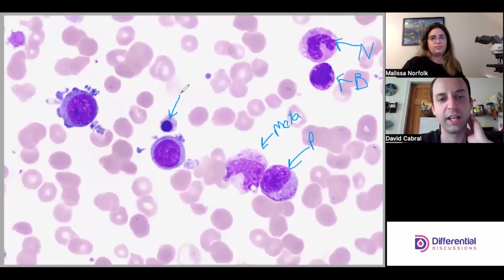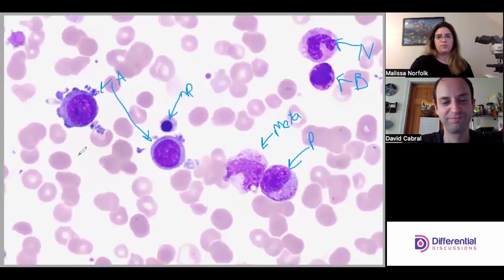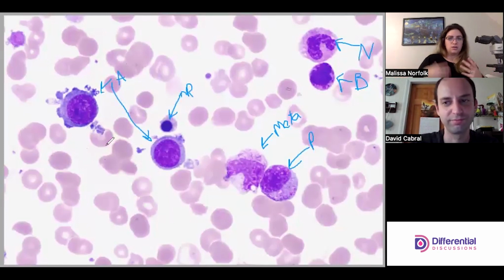And then we have two of our abnormal megakaryocyte cells, megakaryoblasts. They're beautiful. Look at the blebs. Look at how blebby they are and how funky looking. It does look almost lymphy. This one almost looks more plasma cell-y with the super round nucleus and very eccentrically placed, but it just doesn't look right. So there's something abnormal about it. So we know we're looking at this cell. I'm talking about mostly this one right here, but we're looking at it.